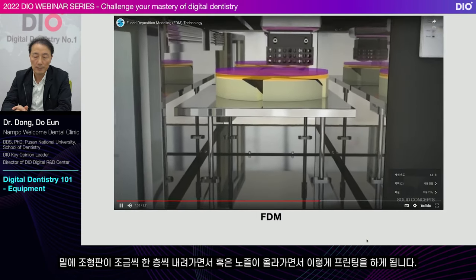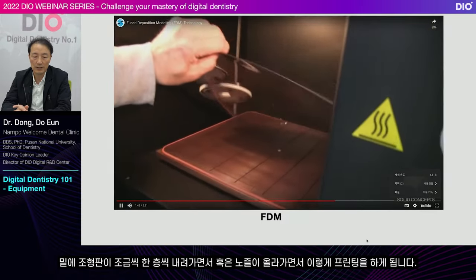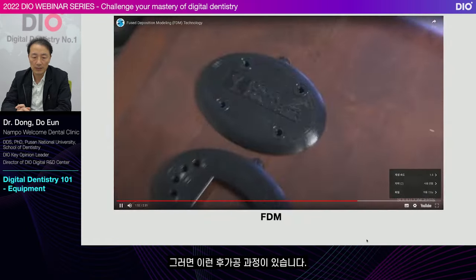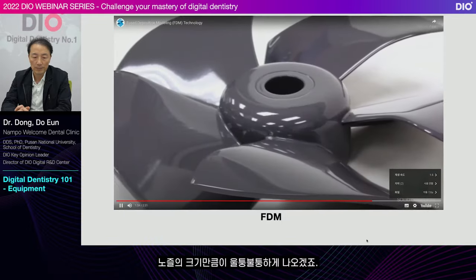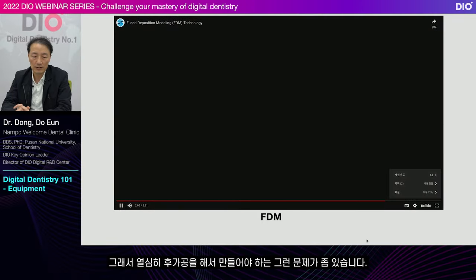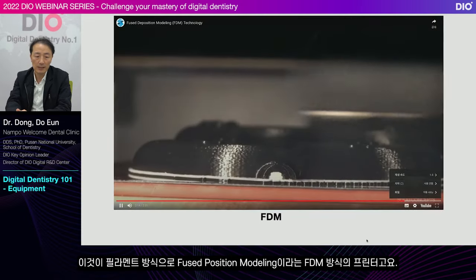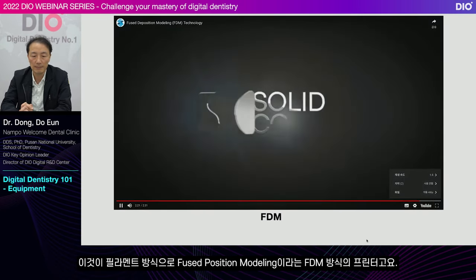The printing proceeds like this as the molding plate below moves down one step, or as the nozzle moves up. Then there is a post-treatment process. It comes out unevenly in the size of the nozzle. So there is the problem that you need to really work on the post-treatment. The printer's filament method is called the FDM method, or fused deposition modeling.